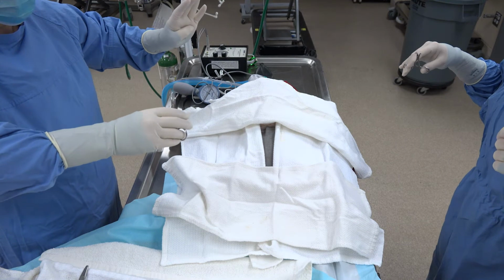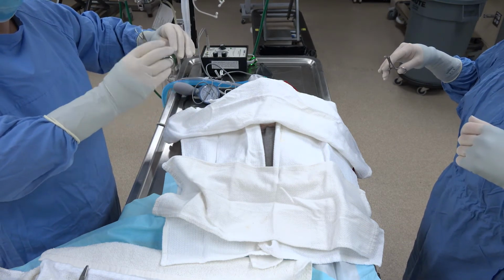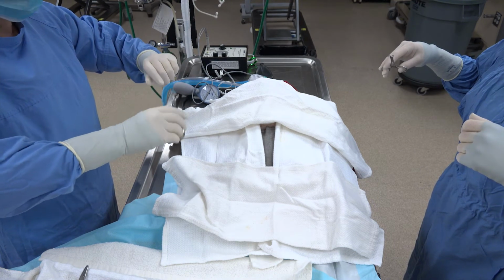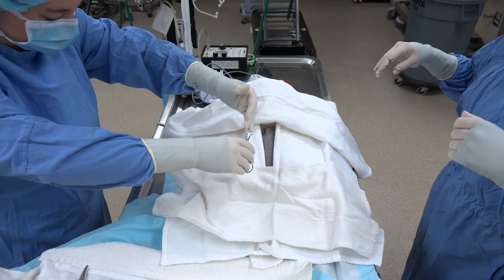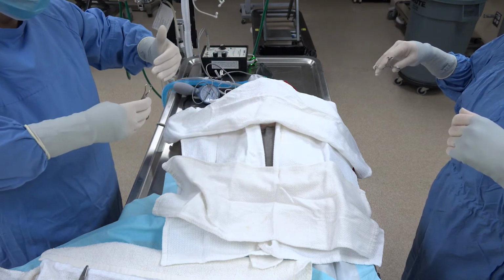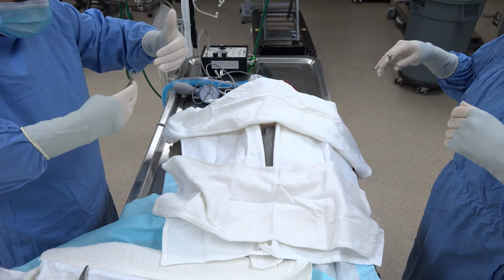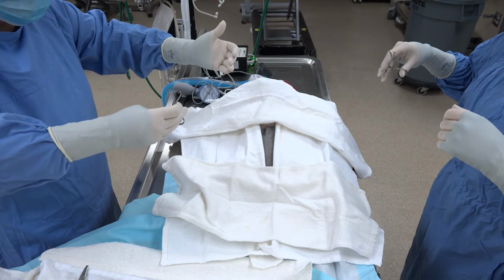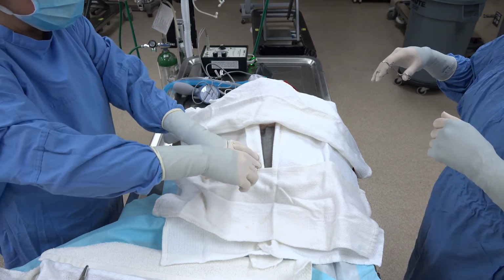Everybody should be paying attention. Everybody should have a healthy dose of paranoia because you can't always feel it when you touch something. So if somebody says, hey, I think you touched something, you probably did. The other thing that happens is as you're leaning over to drape something, your gown is poofy and it touches the table. So watch out. You have to have a healthy distance away from the table so that just the weight of your gown doesn't pull off of you. This is super important because that's where a lot of contamination occurs.